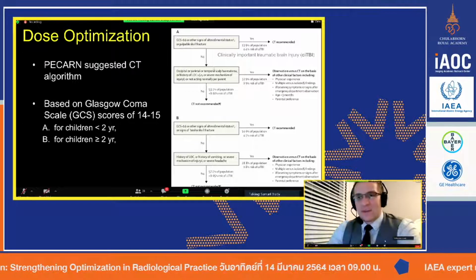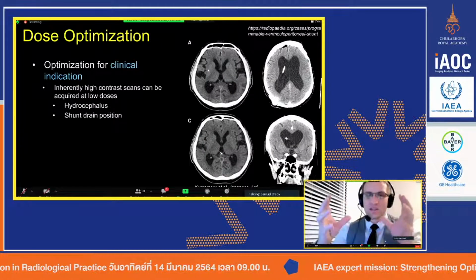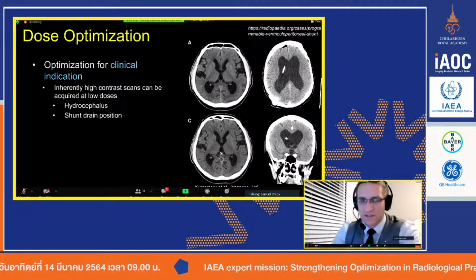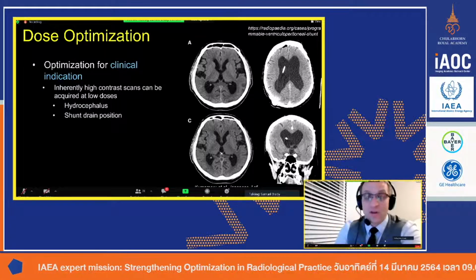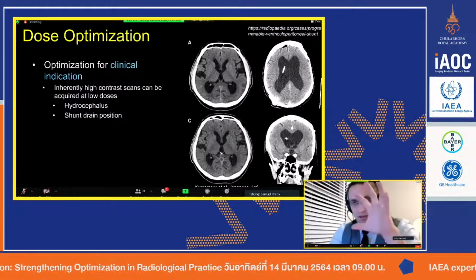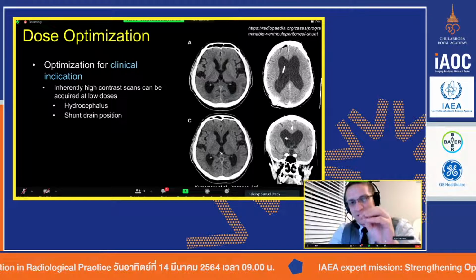And so setting up an idea of when to CT scan is probably, as I've already said once, I'll say it again, one of the best ways to reduce, quote unquote, radiation dose to kids, but even adults. And that's probably higher than the dose optimization team.